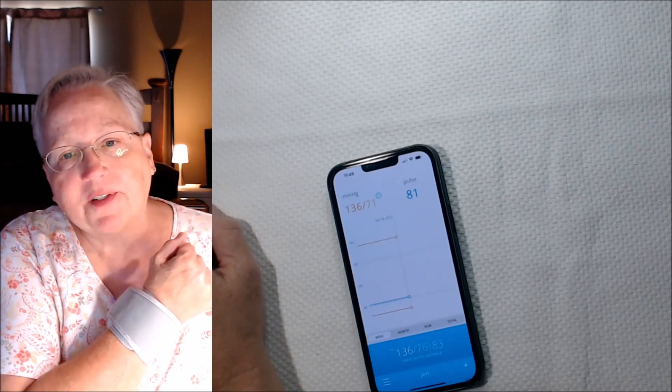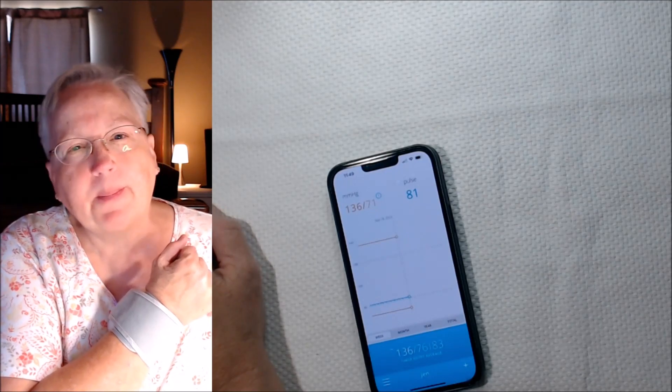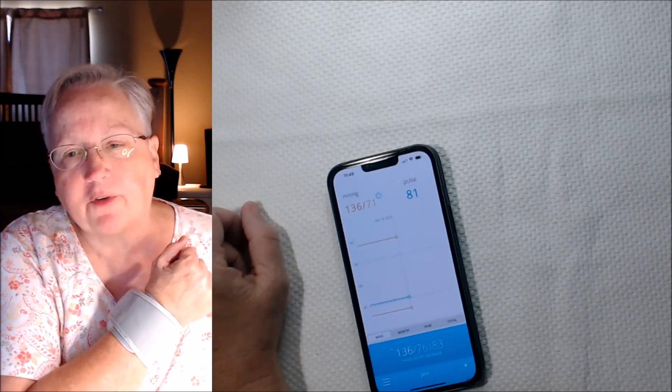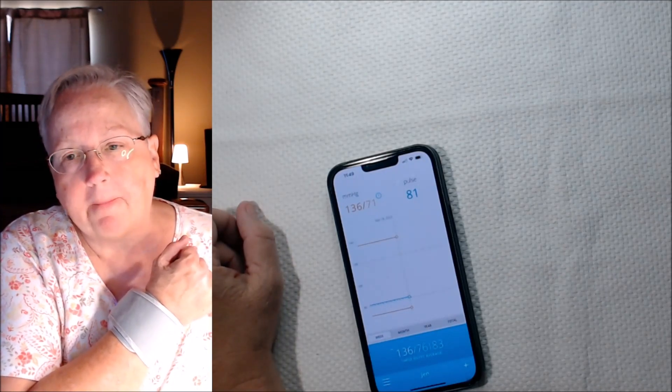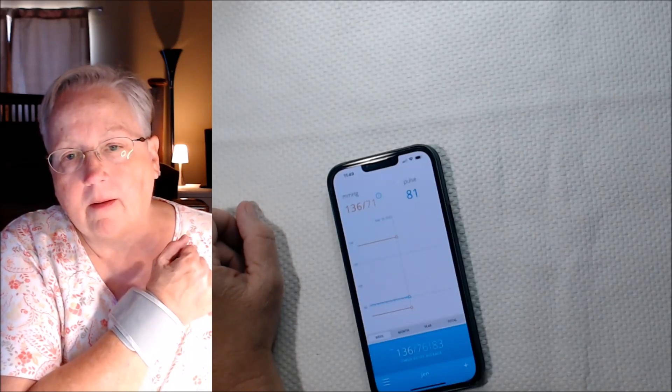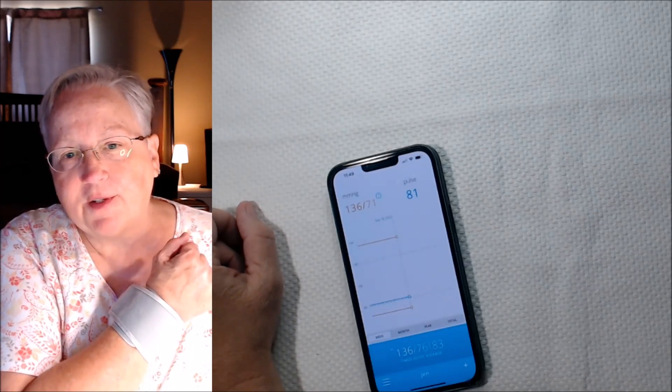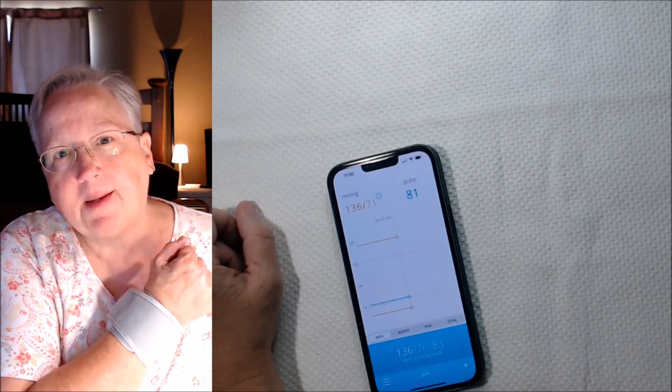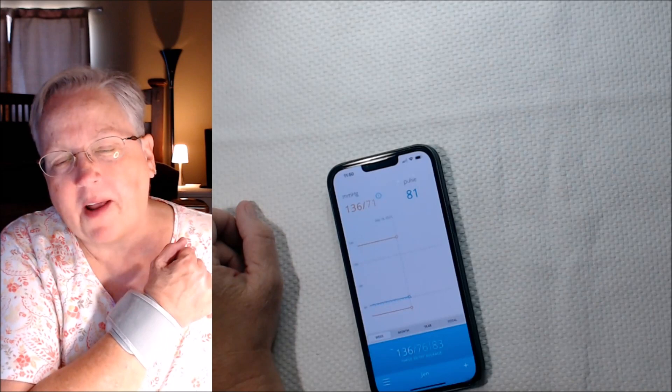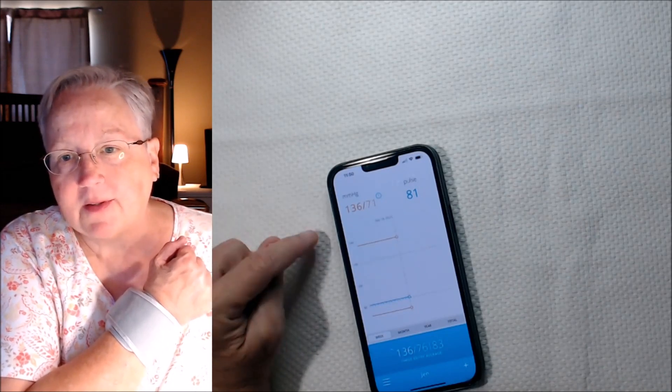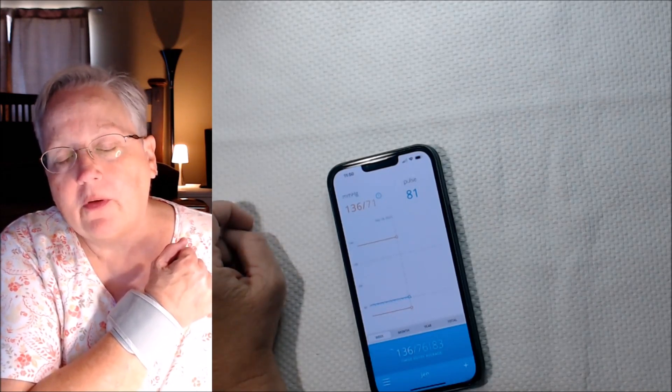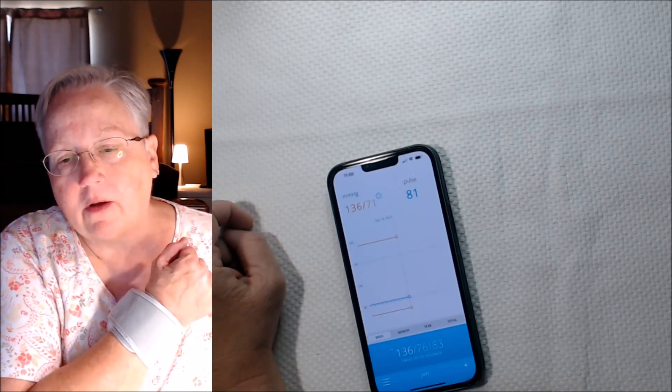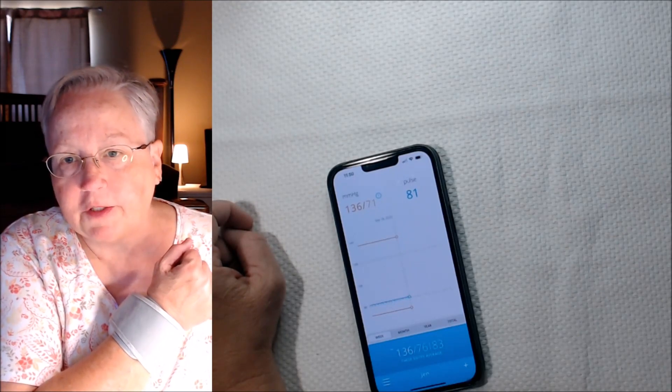And after it stops, it'll take a couple seconds, maybe ten seconds for the app to read it. But it's good. Easy way to keep track. Don't have to write it down all the time. This will keep a running total of your blood pressures.